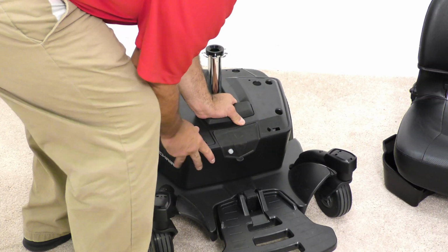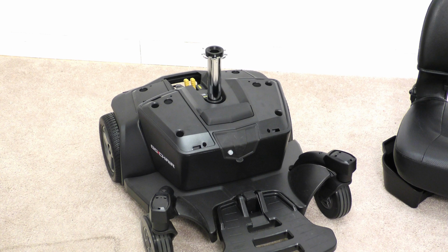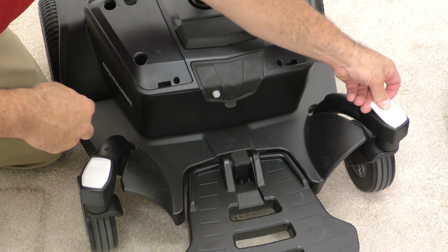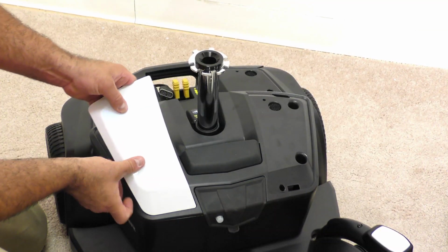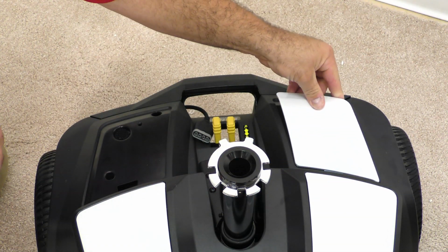Next, place the battery box on the base. Before placement of the seat, attach the color shrouds to the base, 2 of the front caster caps, 2 on the battery box, and 2 on the rear unit.